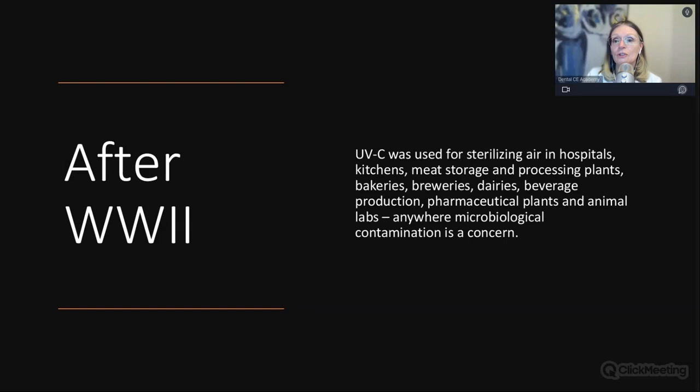And then UVC was used for sterilizing the air to improve air quality in hospitals, also kitchens, used in meat storage and processing and packing plants. I saw bakeries, breweries, dairies, beverage production, pharmaceutical plants, and animal labs, anywhere microbiological contamination is a concern.